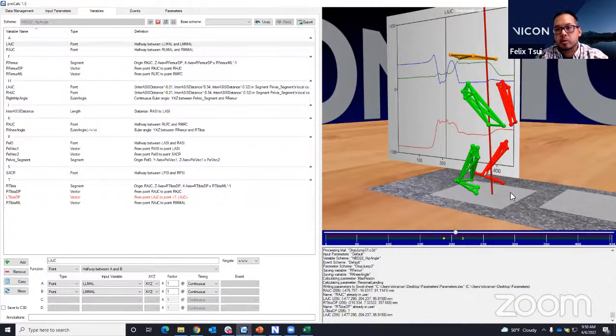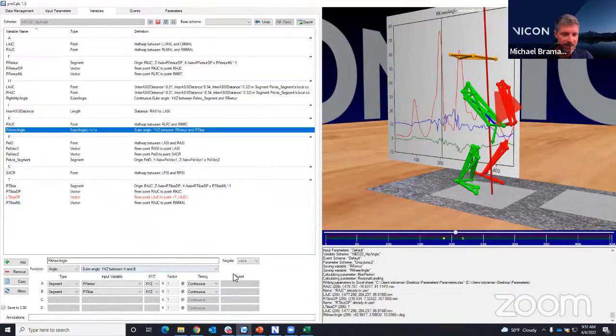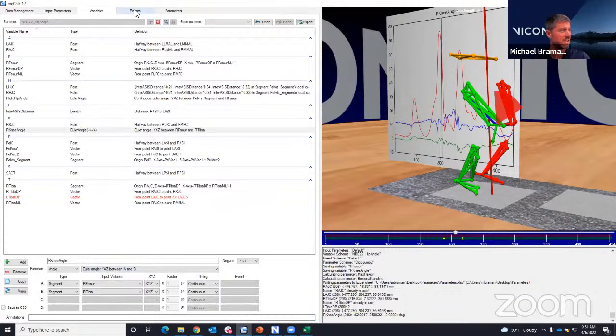And so then the next question is, can you do conditional calculations? I'm assuming like if this exists, then do this. I guess there is, let's see. I think there's a lot more conditions. We do have conditions as far as timing goes. There are quite a few different ways that you can bring things like that in. I think a lot of the conditions might go within the events. That's probably how I'd handle that.